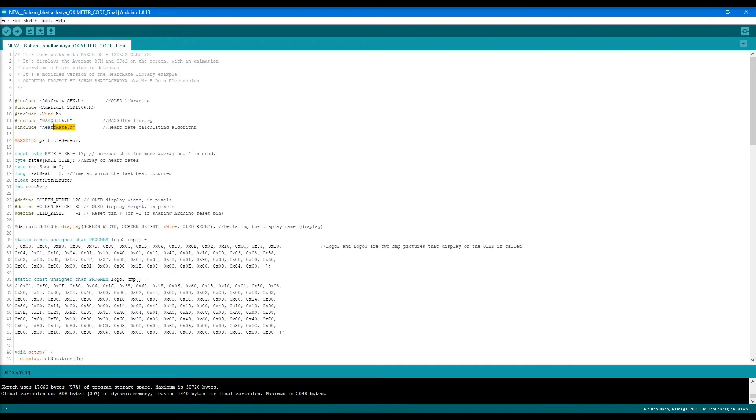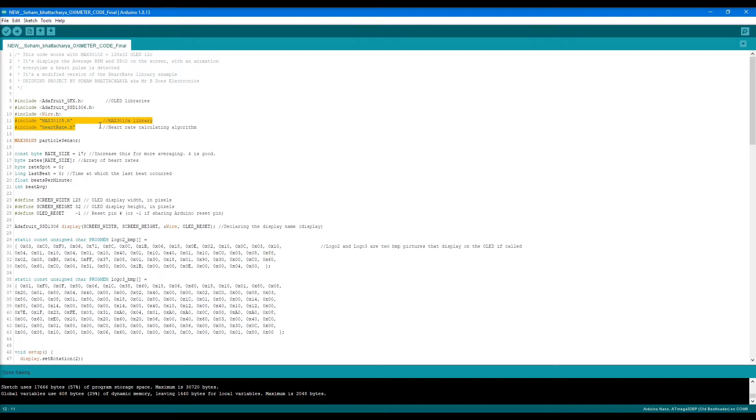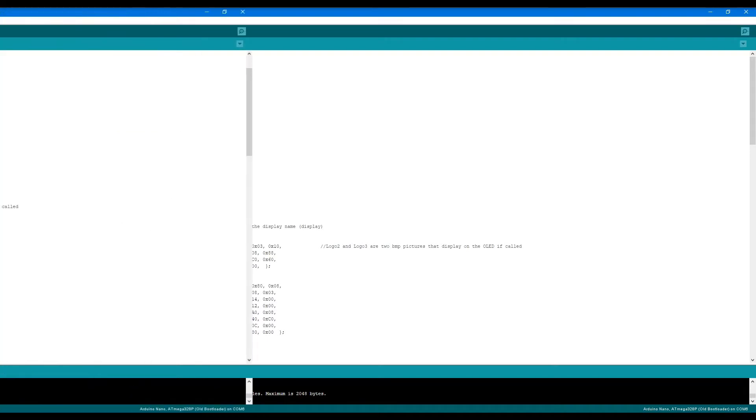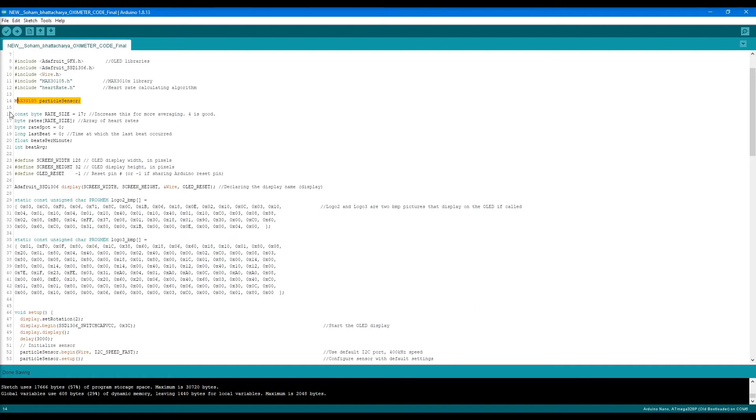Line 11 to line 12, these are the heart rate calculation and the MAX30105 library. These are required to calculate the heart rate and to integrate or use the MAX30102 sensor with the Arduino.